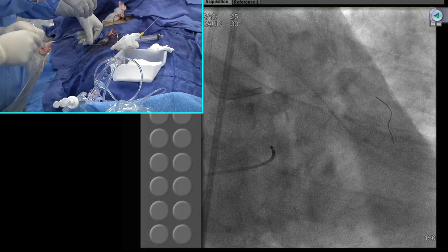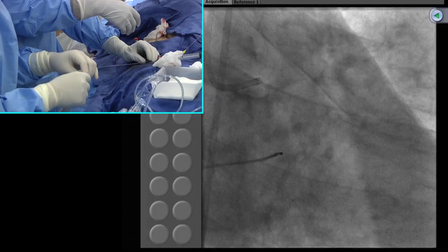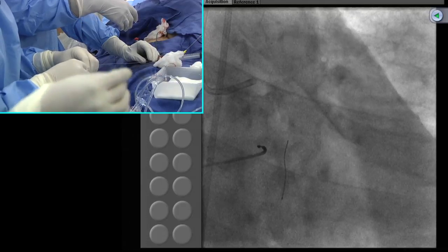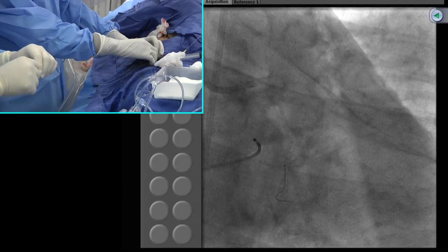And the company is making some changes in the rotawire. They had a good one, the Elite, which had a voluntary recall, whatever the terminology Boston Scientific uses, but the wire is no longer available. That's basically the matter. So you'll go back with the 175 there?